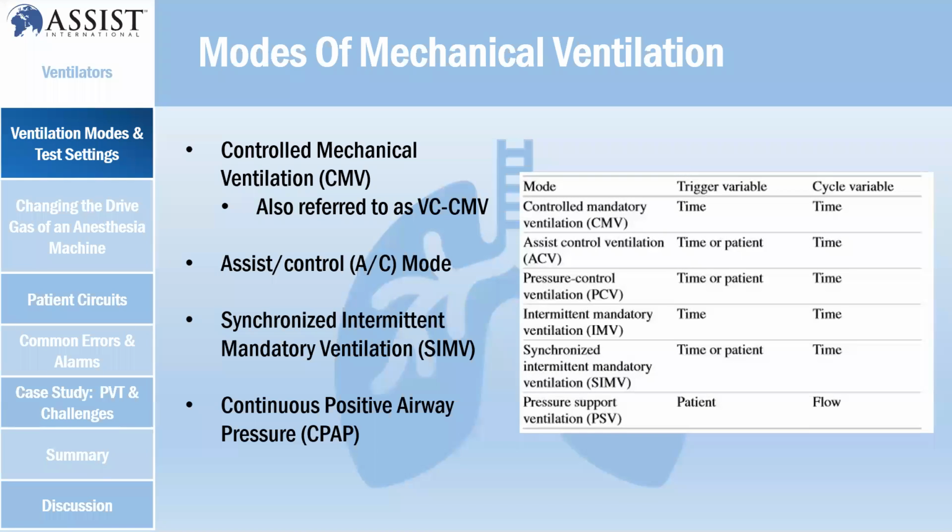So you've got control mechanical ventilator, CMV, then assist control, synchronized intermittent mandatory ventilation, and continuous positive airway pressure, CPAP. But there are a lot of other controls that depend on the model of your ventilator.